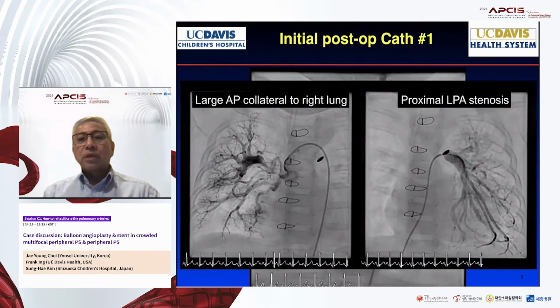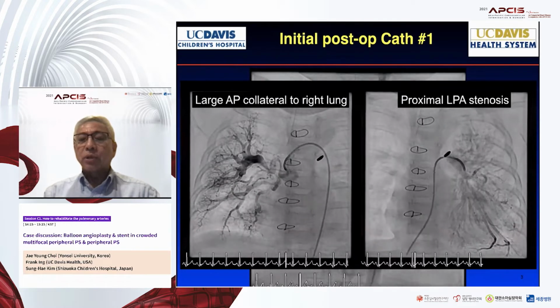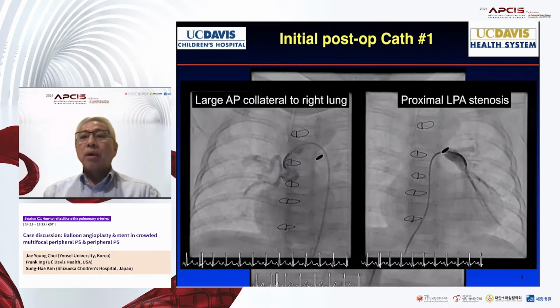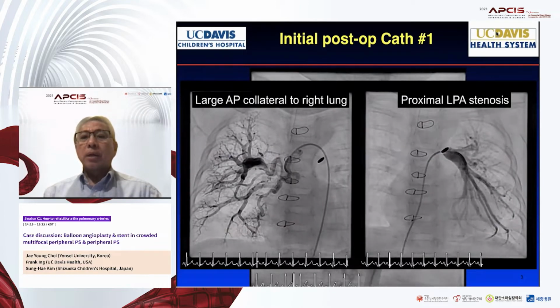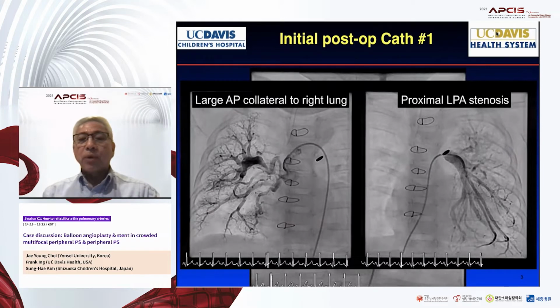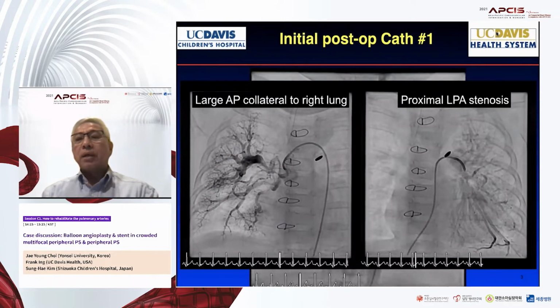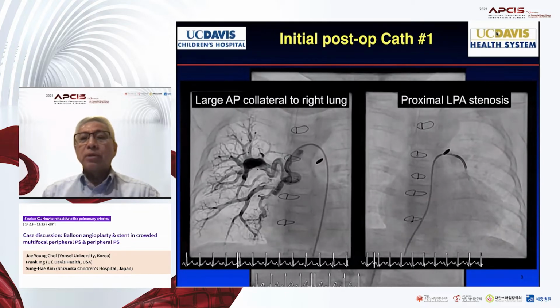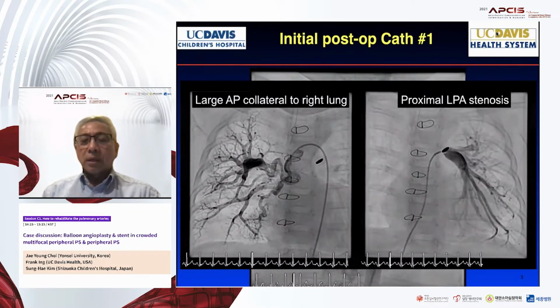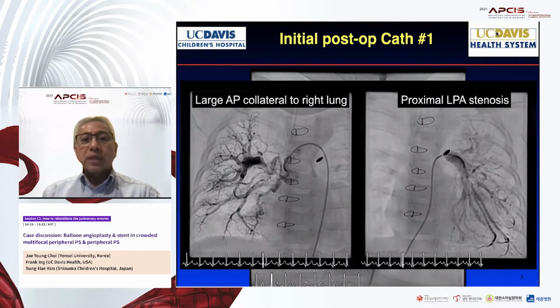You can see there's a clip there, and when I went through the right heart, I could see that the right ventricle is connected to what appears to be a pretty reasonable left lung here. But here you have a separate collateral flow to the right lung, and an MPA to LPA, RV to left lung connection with a severe stenosis. So this was presented to our surgeon.